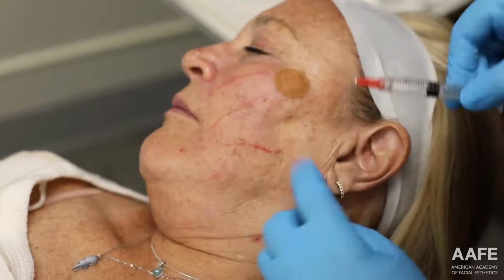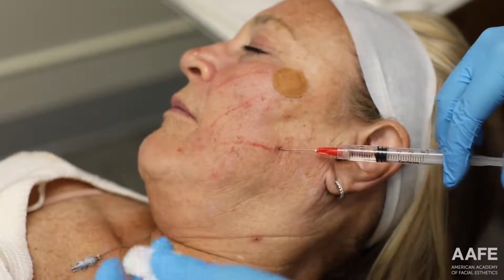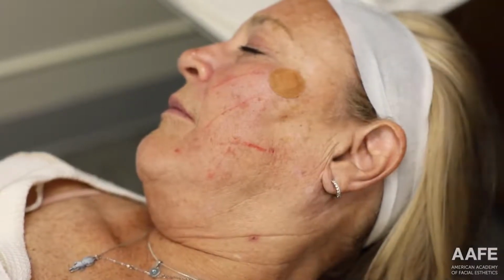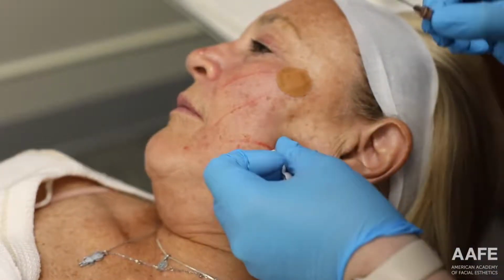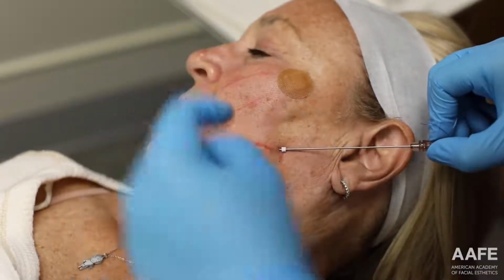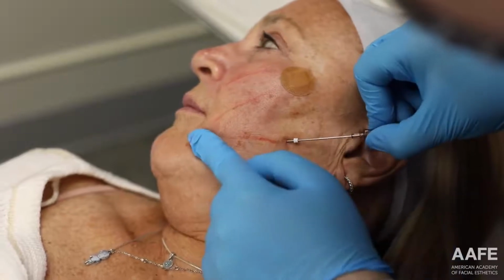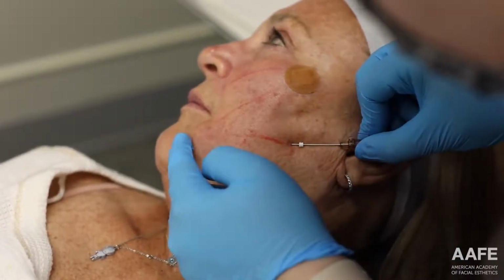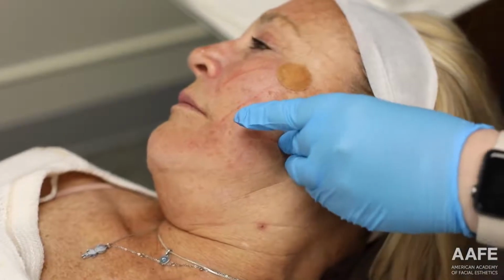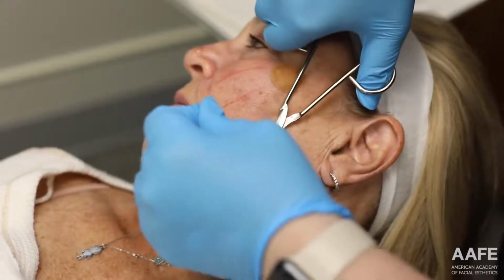And then again, going in with my cannula. Big burn. And then my last thread. I find the jawline easier to pull it taut back as opposed to pinching up the skin or bunching up the skin. I just feel like it's much easier and you can really stay in the correct plane. Smidge further. Okay, that's it. So then let's just cut.